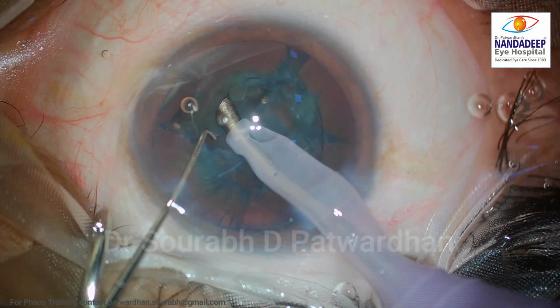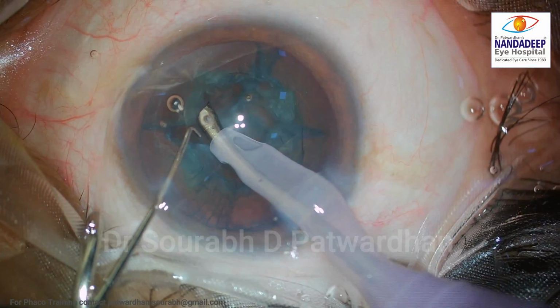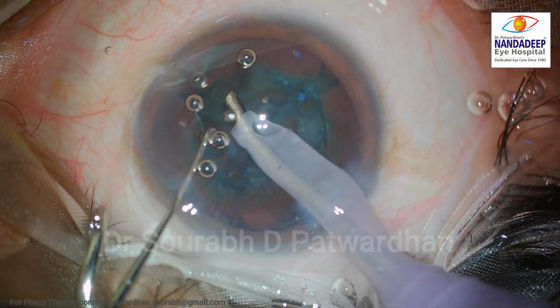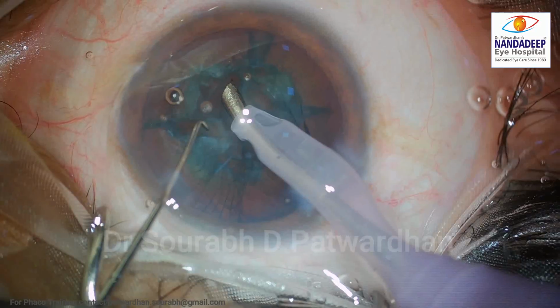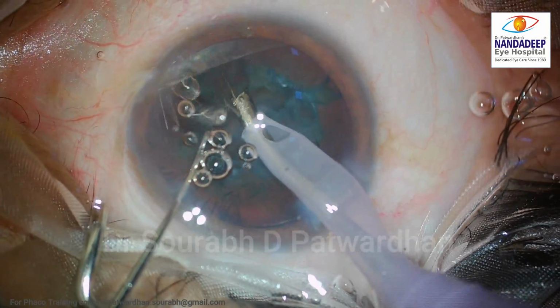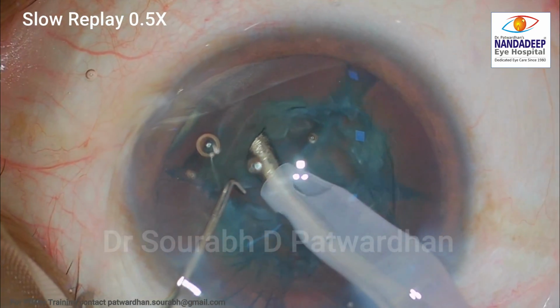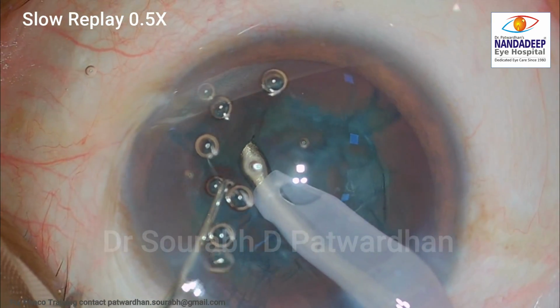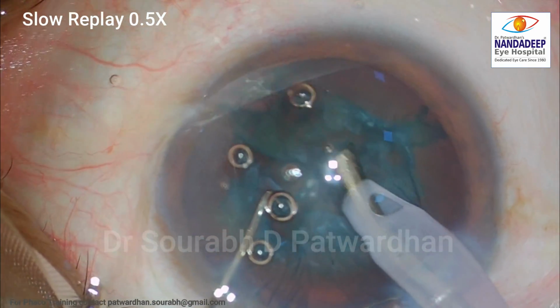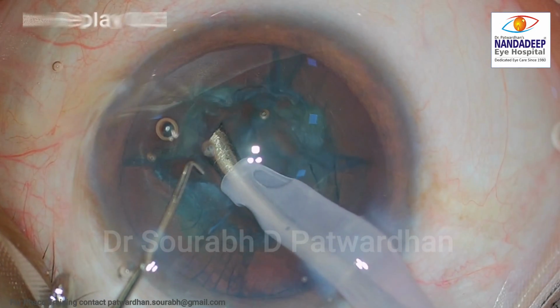So you can see there is a gush of air, first little bubbles, then there is more gush of air there, and I just wanted to see where exactly these bubbles are coming from. So I decided to slow down the video a bit and look for where exactly it is coming from. It looks as if it's coming from the sleeve, and that's what is expected.